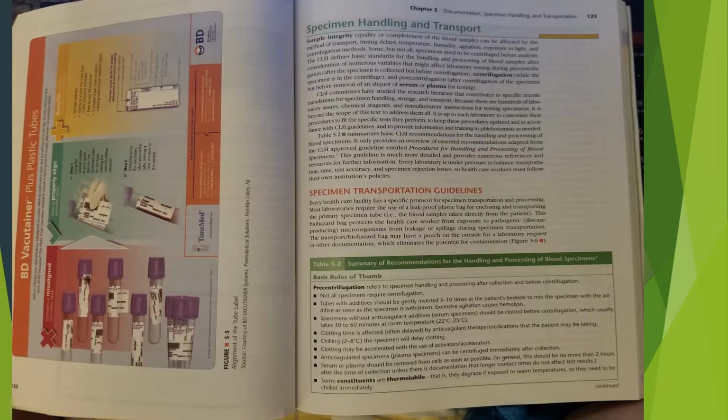CLSI committees have studied the research literature that contributes to specific recommendations for specimen handling, storage, and transport. Because there are hundreds of laboratory assays, chemical reagents, and manufacturer's instructions for testing specimens, it is beyond the scope of this text to address them all. It is up to each laboratory to customize their procedures to fit the specific tests they perform, to keep these procedures updated and in accordance with CLSI guidelines, and to provide information and training to phlebotomists as needed. Table 5.2 summarizes basic CLSI recommendations for the handling and processing of blood specimens.